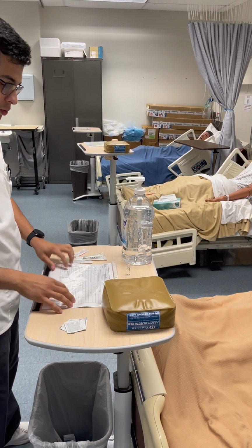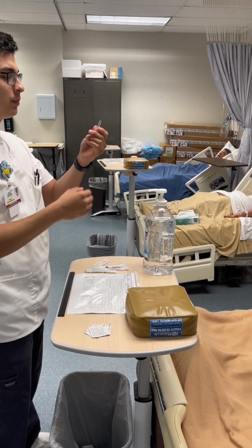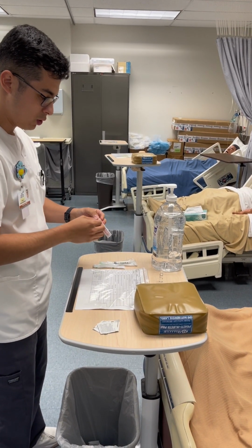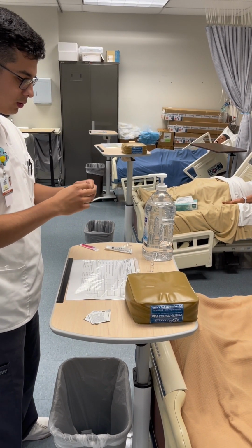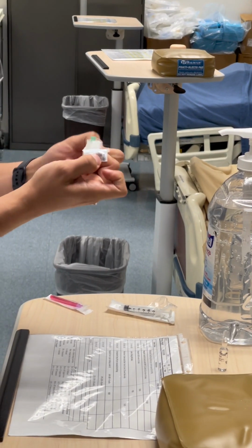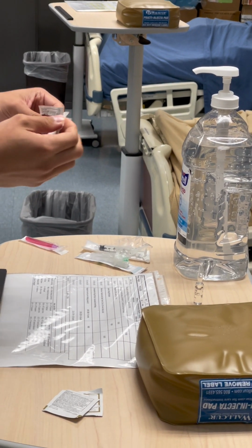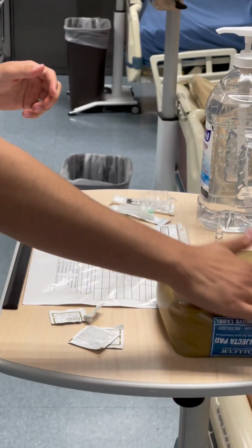Okay, so first thing I want to do is swirl the ampule. If there's any medication left on top, I just want to get it all the way to the bottom. And then you just use a little motion. Looks like all the medication is all the way in the bottom. I'm going to open up everything. Okay. Now, I'm going to be administering this on your right deltoid. So go ahead and lift up your sleeve for me. Awesome. So I'm just preparing the deltoid.